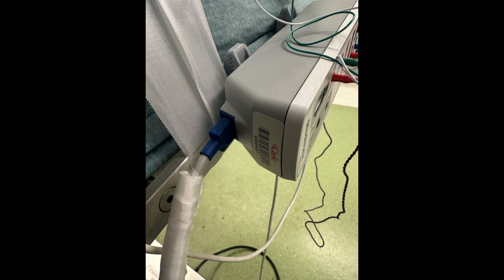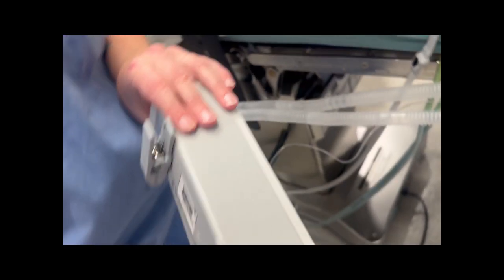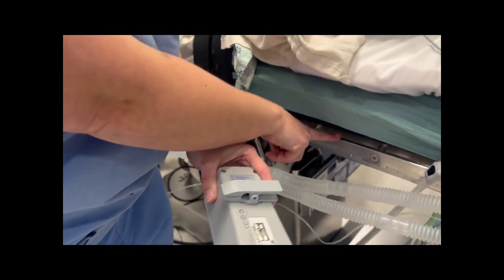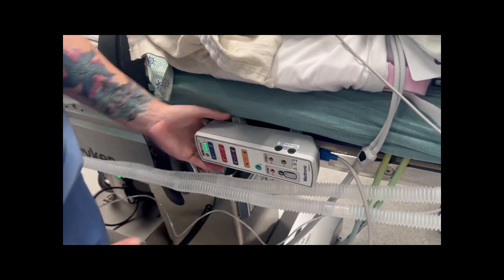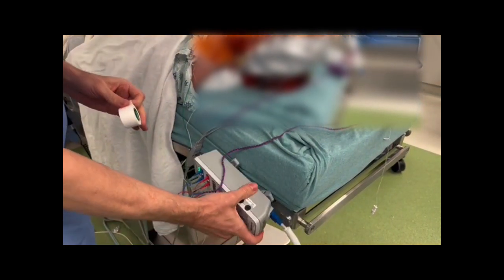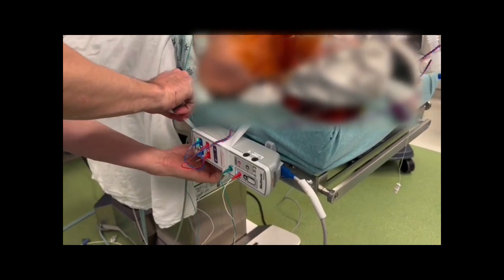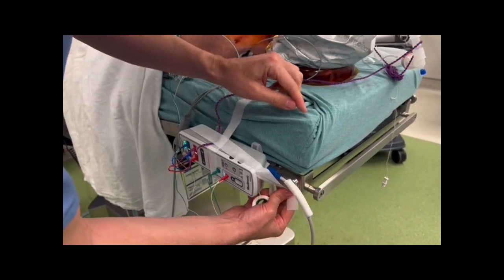The clips on the patient interface may be rotated so that they slide easily on the rail on the side of the operating room table. Beware that the console can easily be displaced with a little bit of movement under the drapes accidentally, and then it falls to the ground and pulls on the leads — which is not good — so I recommend taping it down as shown.